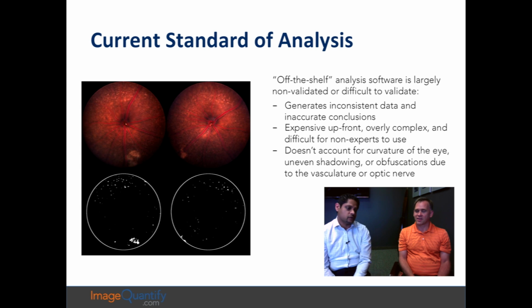So trying to get the lesions but not the rest of that halo is tricky. And so that's what's going on here. I think the researcher used a threshold and said, well, I'm going to try to get as much of the lesions as I can without picking up the rest of the halo. But then you miss, like on the bottom of the screen, a majority of that lesion. You're talking about the bottom left. Right. And so it just makes it trickier.